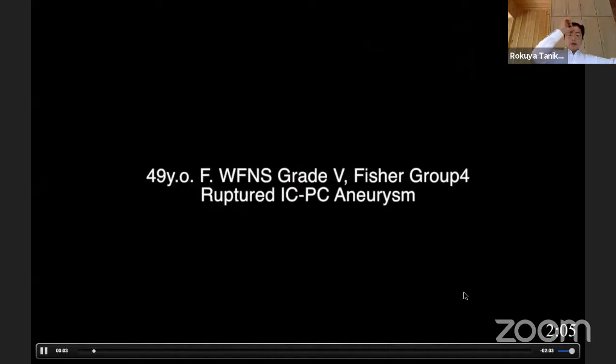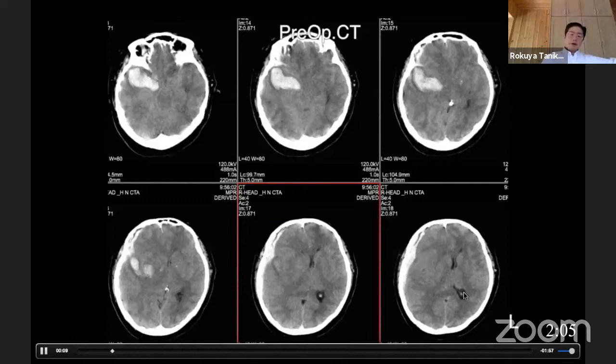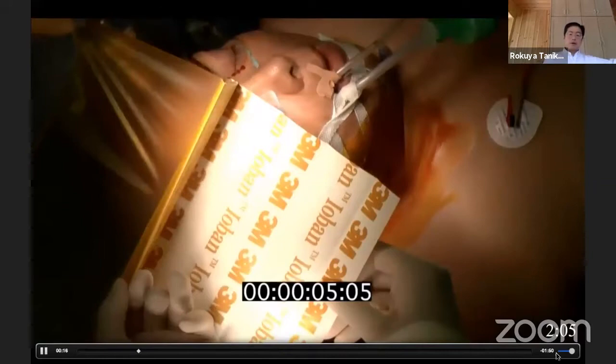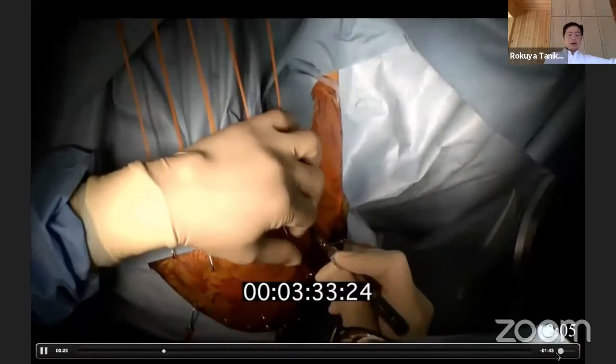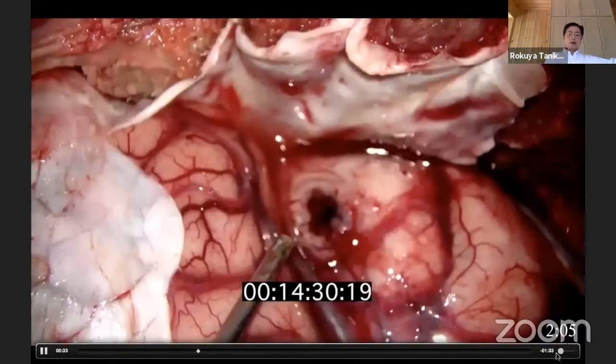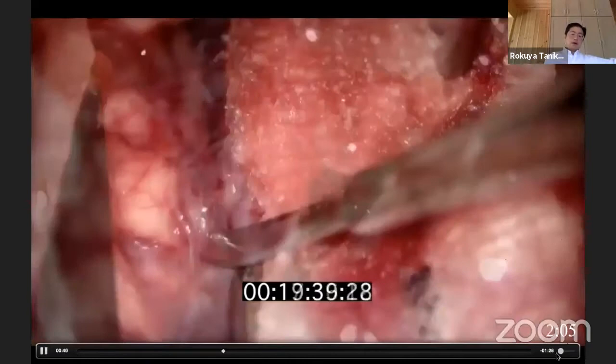The next case is a subarachnoid hemorrhage with a temporal hematoma — a relatively large ruptured aneurysm on the right side. This is a real-time video of acute surgery. The preparation is finished and the skin incision has begun. In 10–12 minutes, the dura is open, and here is the orifice of the temporal hematoma.